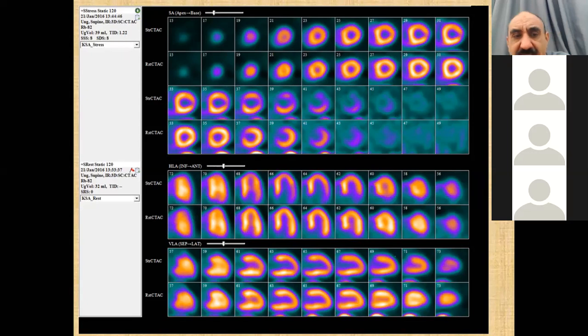Usually the TID is 1. The cavity of the left ventricle should be equal during stress and rest. And if it is bigger during stress, that indicates severe multivessel disease or very proximal LAD disease. This patient had ischemia on the lateral wall, the circumflex artery, which is unlikely to produce the TID. So it means that the patient has triple vessel disease, and the circumflex artery may be the culprit for the presentation with chest pain.